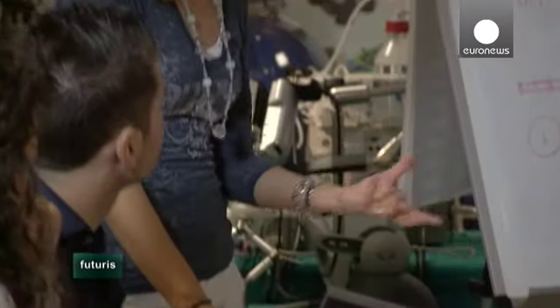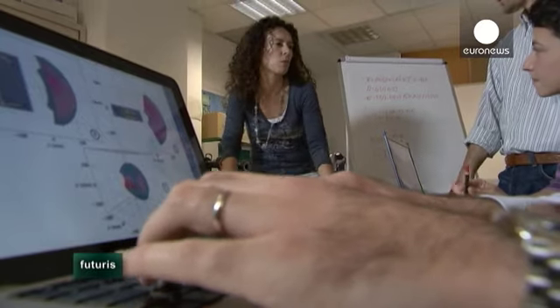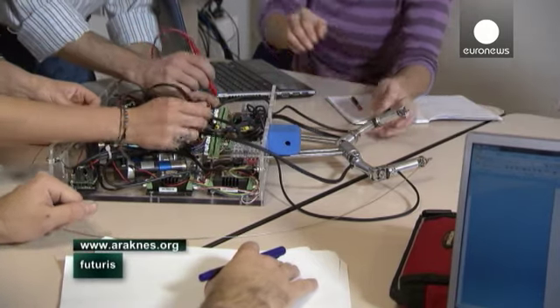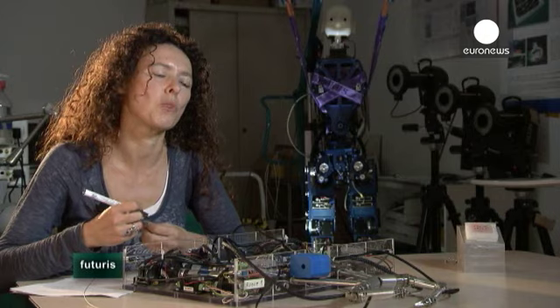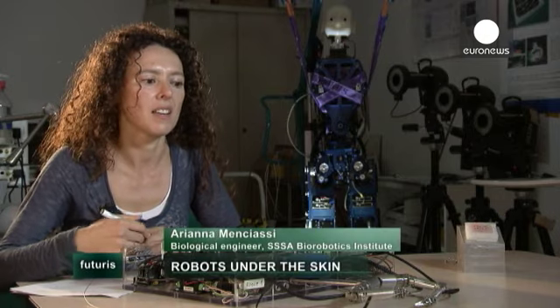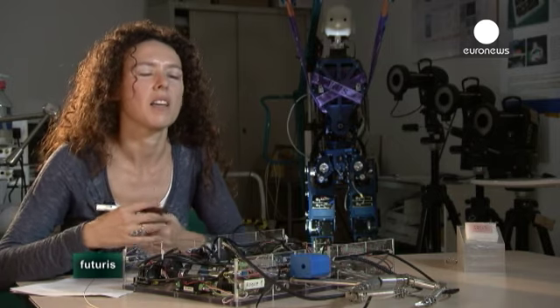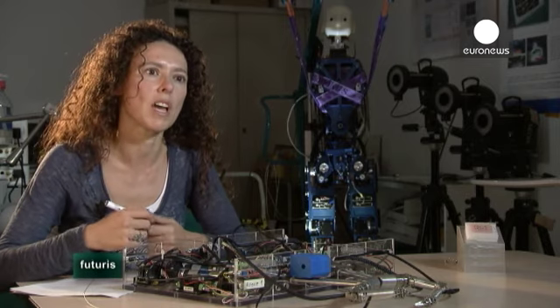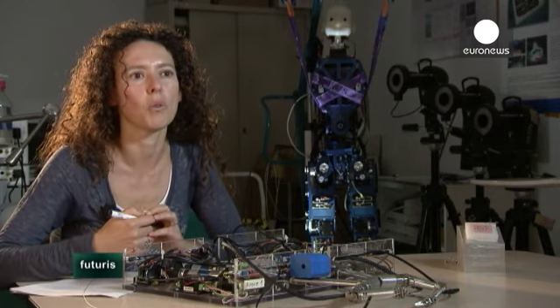Researchers are now making plans to bring the prototype into real operation theatres. But before this can become a reality, there are still a few things which need to be ironed out. Before the robot can be mass-produced, we first have to think about how to sterilise the motors. We'll also have to do more research on some of its mechanical features so that they can become more reliable and less expensive.